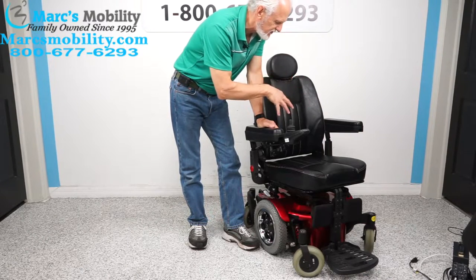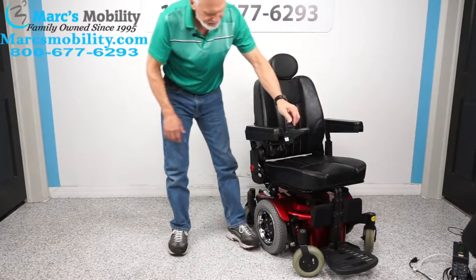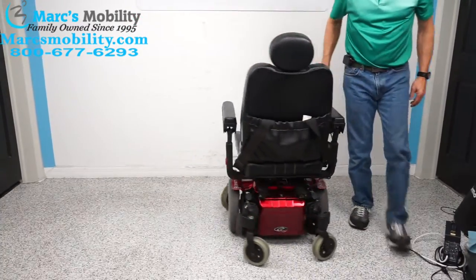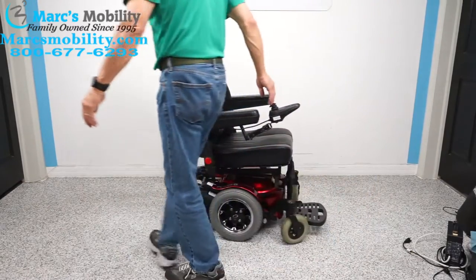I don't have extra seats for this model, so this is the seat that comes with this chair — 19 by 18 captain seat. And if you can see the turning radius on this chair, it's really small. But when you see it outside, it rides like a little Porsche.